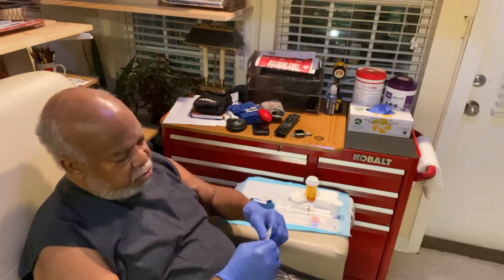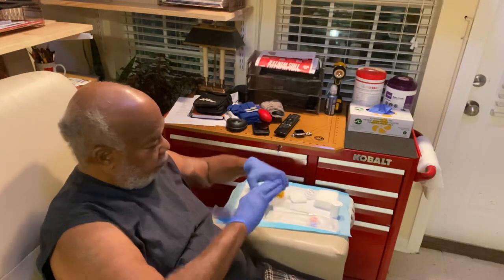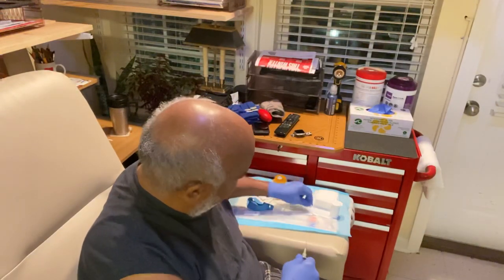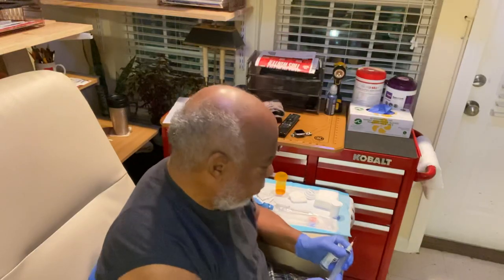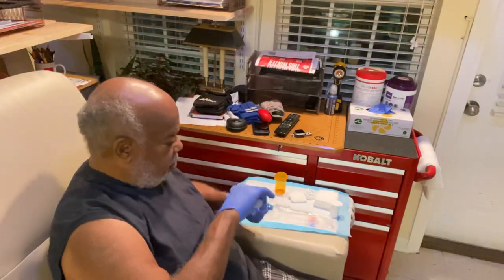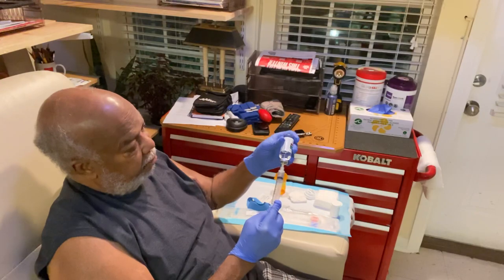So, without further ado, here we go. First of all, we're going to set up our heparin bolus, and our prescription calls for 2,000 units of heparin per treatment. The heparin is somewhat of a blood-thinning agent which prevents the fistula and the flow of blood from clotting during treatment.